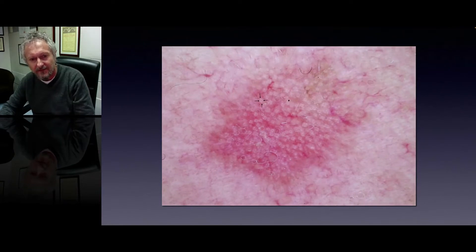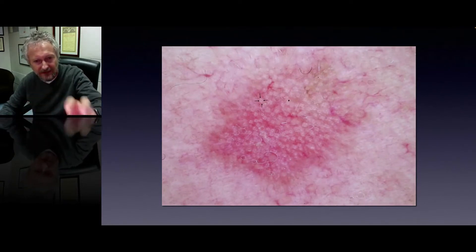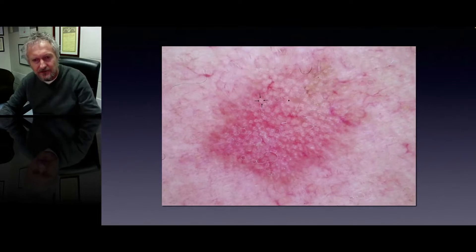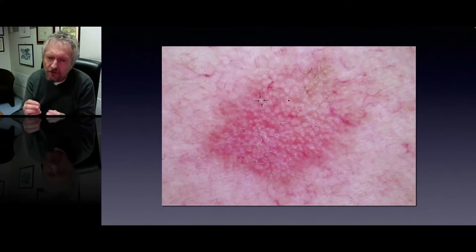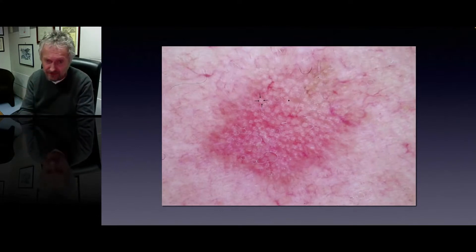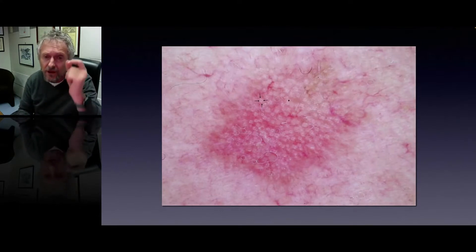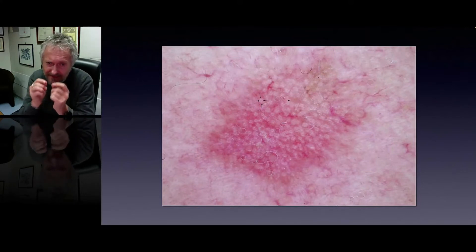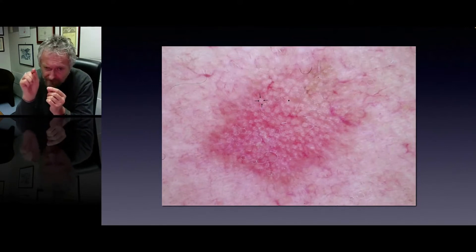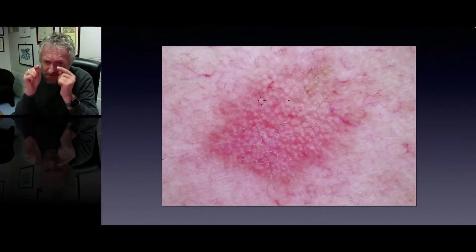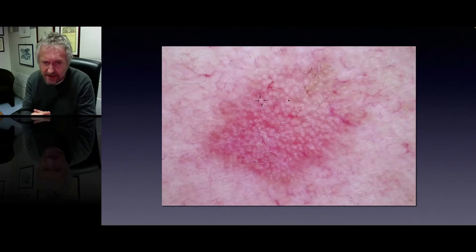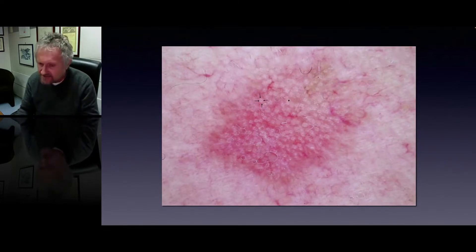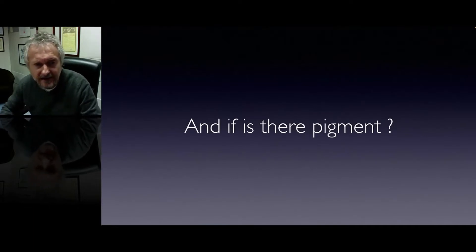Here is another example of this strawberry pattern with the red pseudo-network. You can also see an additional feature very nicely demonstrated through the use of polarized light dermatoscopes: the presence of rosettes. A rosette is the presence of four white dots within the follicle. This is very specific for actinic keratosis.